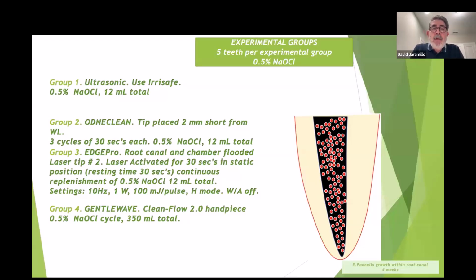The term should be ultrasonic activated irrigation. And he used ultra high speed movies to show how the ultrasonic probe constantly contacts the canal wall. So by having this contact, it cannot be passive. So he proposed to change the name of passive ultrasonic irrigation to ultrasonic activated irrigation. So I'm totally in favor of that.